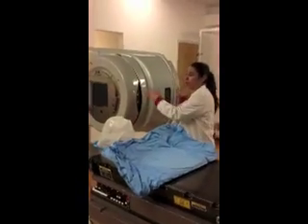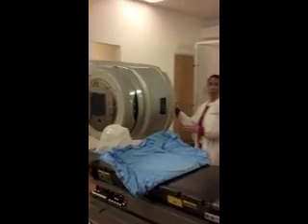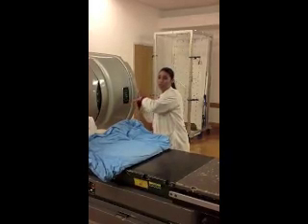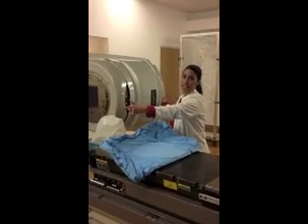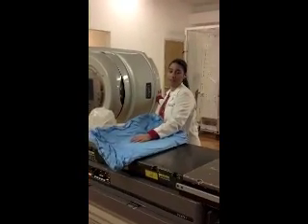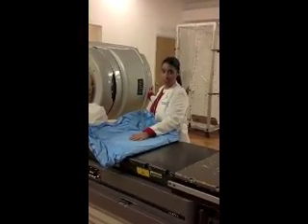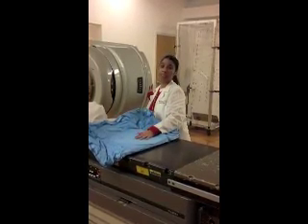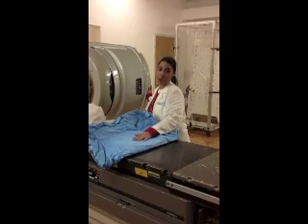The gantry itself will treat one lateral field for so many monitor units as was described in the radiation treatment plan. The gantry will then rotate to the other side and deliver the remaining monitor units, and that will be the course of treatment for that particular day. The patient will come back 10 consecutive days to complete the radiation treatment to a total of 30 gray.